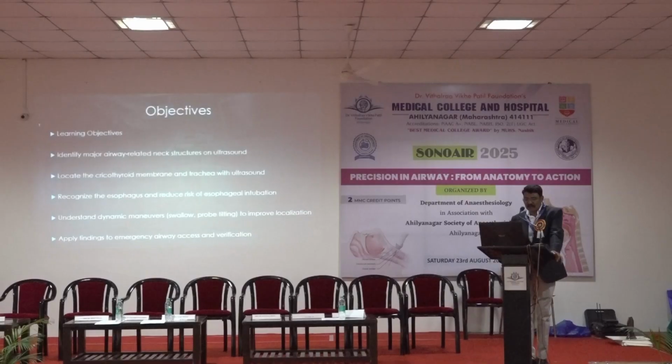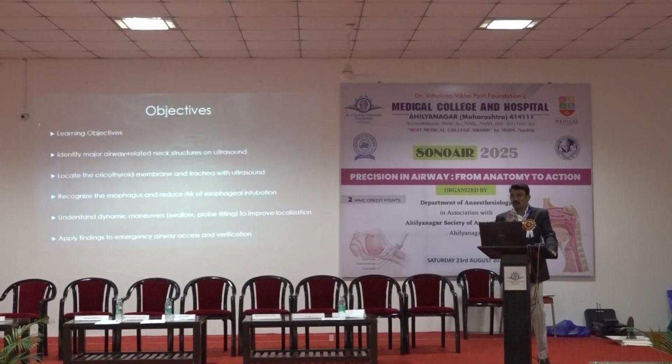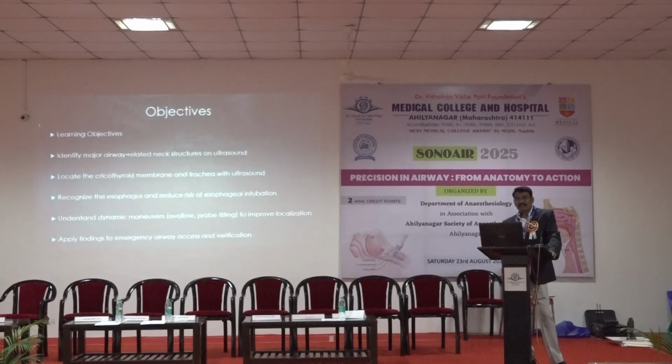The learning objective is the identification of the major airway. Sonography is an easy tool, a bedside portable machine, to identify and locate the structures in the body.